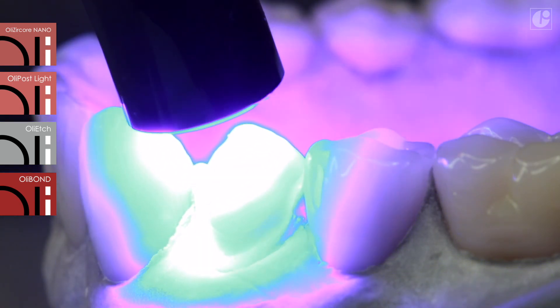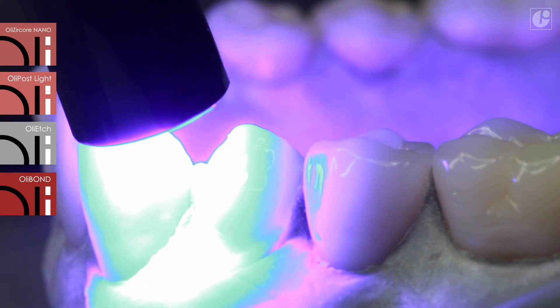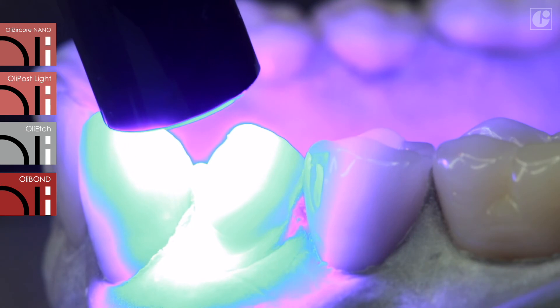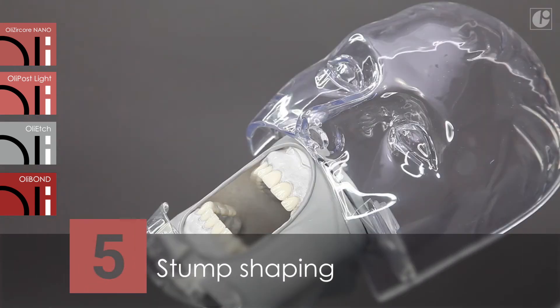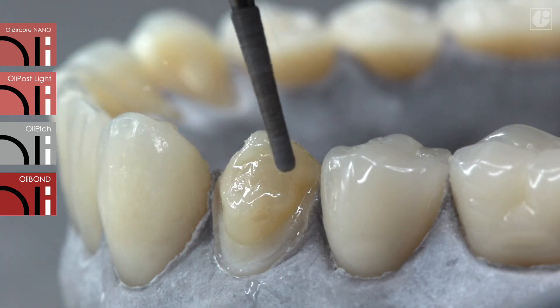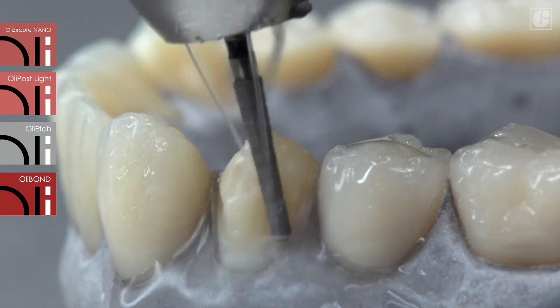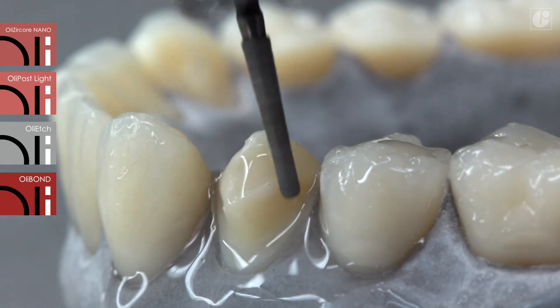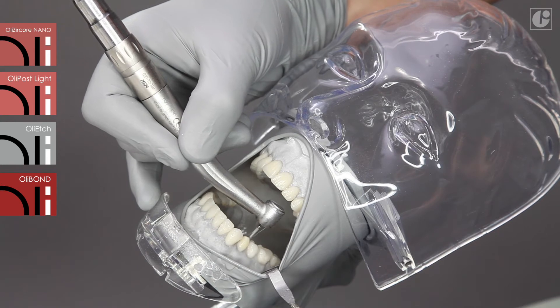20 seconds of light polymerization of the coronal part enables initial stabilization of the reconstruction and post. The entire reconstruction will cure completely within 3 to 4 minutes. Now it is possible to begin the tooth stump shaping. Thanks to its balanced hardness, OliCircore Nano can be cut just like dentine. It ensures controlled substance removal with a burr or finisher and groove-free preparation.